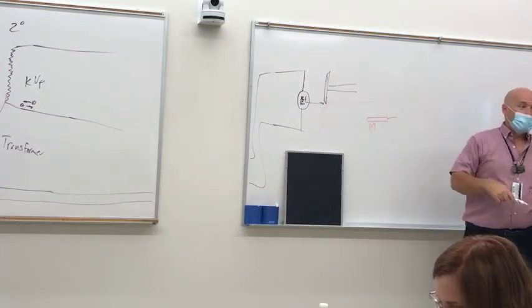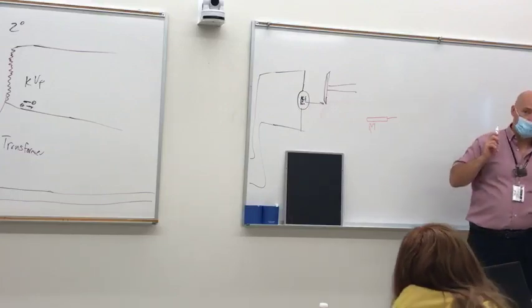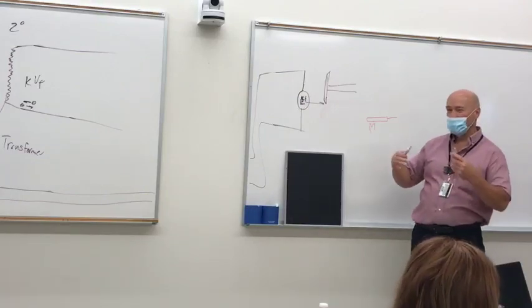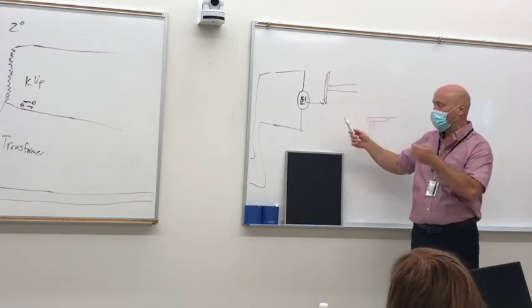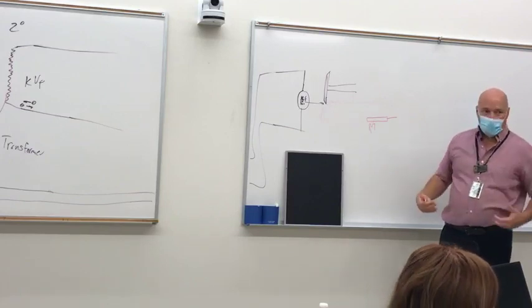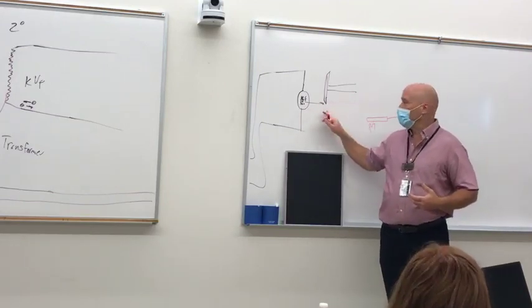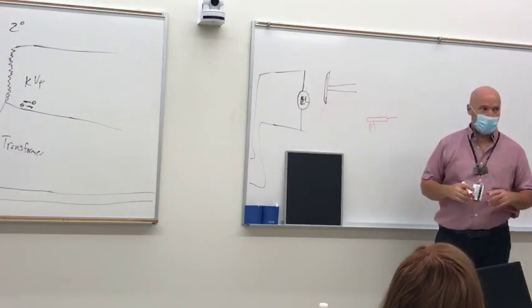Because the main thing that we create in an X-ray tube is heat. The main thing that's going to kill an X-ray tube is heat. So we want to preserve the life of the X-ray tube the best we can. So we're going to spin this around to change the point of impact. We still only at this point have amperage. We have potential energy. We haven't released it yet. Okay? Everybody with me so far?